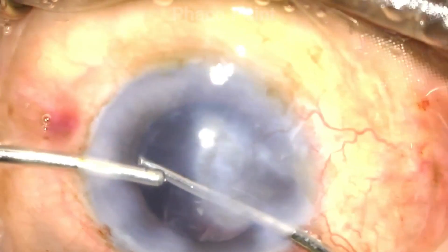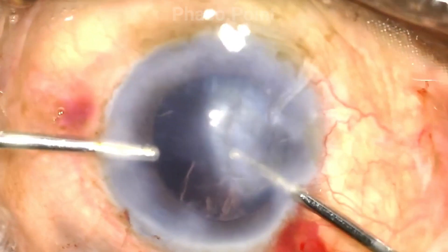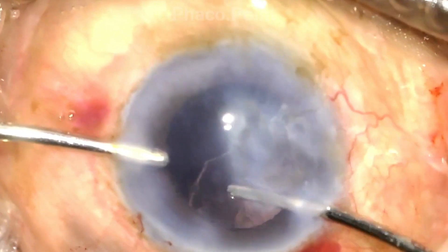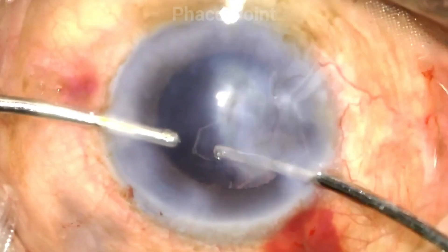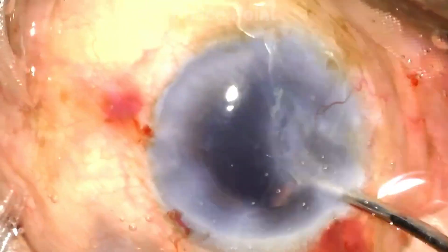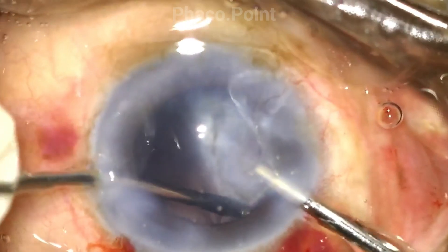Should you not be able to see clearly under the corneal opacity and not be able to remove the cortex underlying it, I think it would be fair to consider implanting the IOL first and then going with the support of the IOL to remove that cortex later.